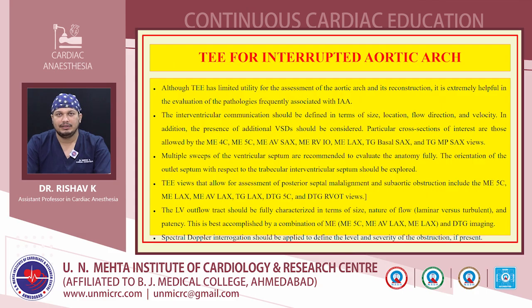The TEE views for assessment of posterior septum malalignment and subaortic obstruction include the mid-esophageal five-chamber, long axis, aortic valve long axis, transgastric long axis, deep transgastric five-chamber and deep transgastric RVOT views. The LV outflow tract should be fully characterized in terms of size, nature of flow and patency, best accomplished by a combination of mid-esophageal and deep transgastric imaging. Also, spectral Doppler interrogation can be applied to define the level and severity of obstruction if present. But all of this is contingent on obtaining a proper view, which in most cases is very difficult or sometimes impossible.